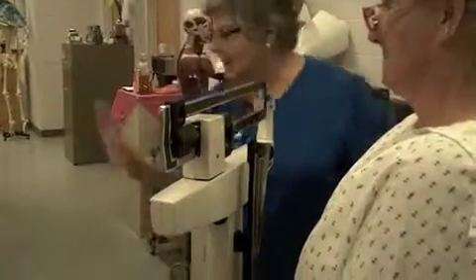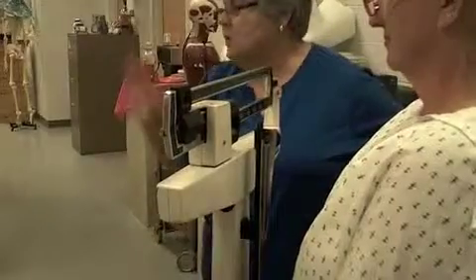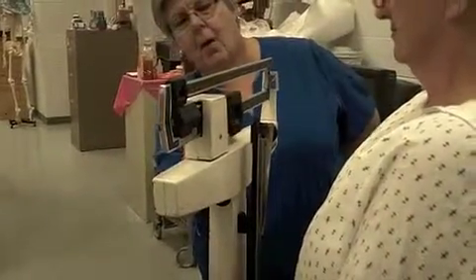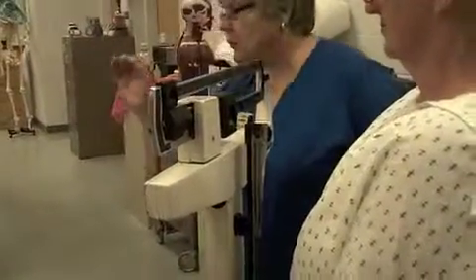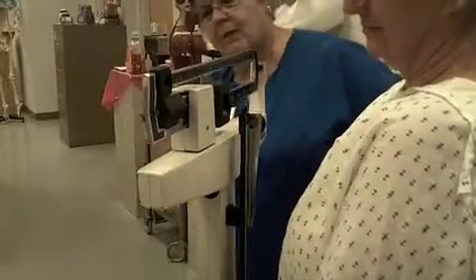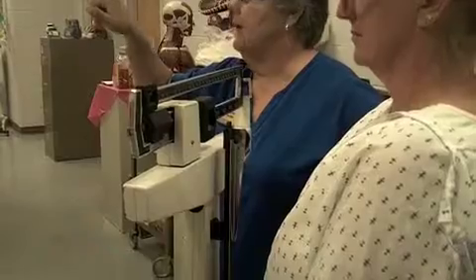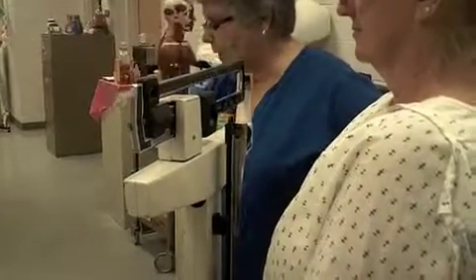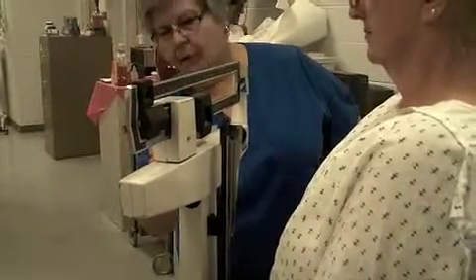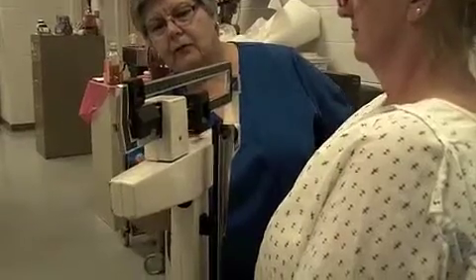All right. Pretend like they only have one hand. We're not making fun of anybody, just to pretend like they only have one hand. Take this bottom bar and move it 1 unit, 1 click of whatever unit. Now in this scale it's easy, it's pounds. Some scales are dual, pounds and kilograms, so they have to be extremely careful. It's in the groove. Tell them they got to be sure they groove it. Got to groove it. Okay? It didn't go down. Slide it to the next groove.